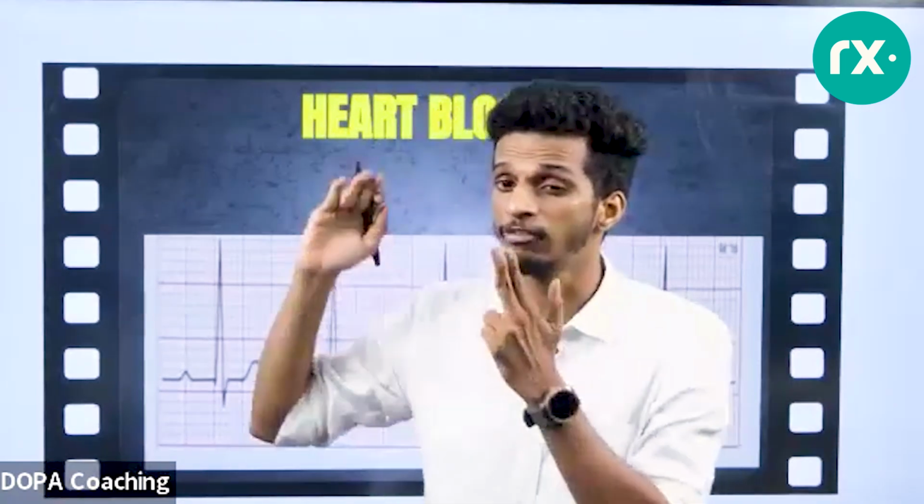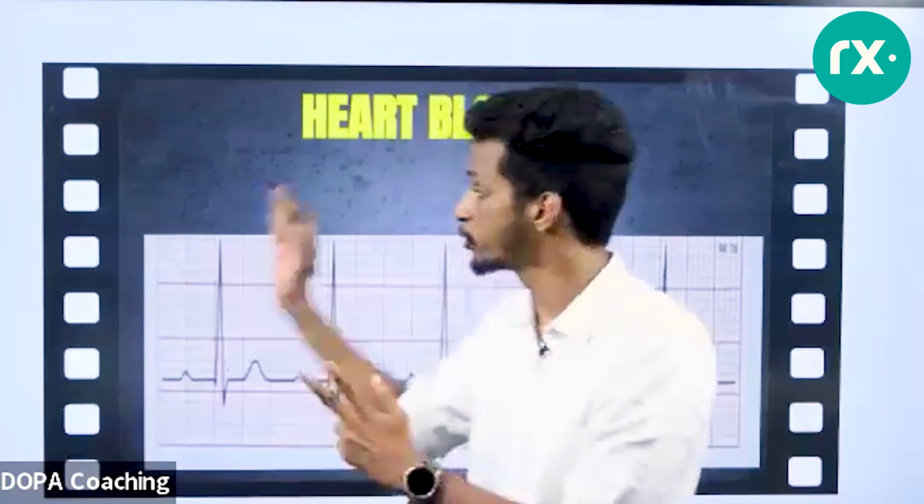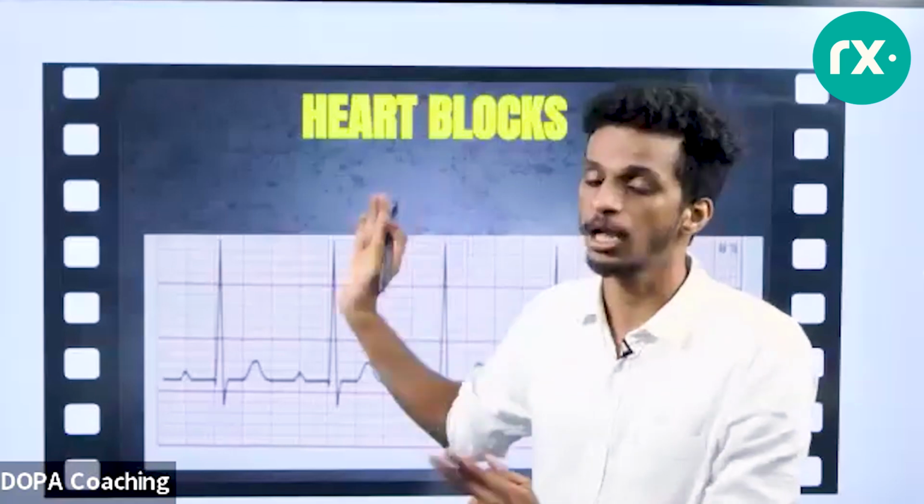We have discussed different arrhythmias like atrial fibrillation, atrial flutter, ventricular tachycardia, ventricular fibrillation, asystole, supraventricular tachycardia. We have discussed all of them. We have discussed the different leads of ECG, which lead corresponds to which wall of the heart. And I have shown you many ECGs showing ischemic changes, and ECGs of STEMI.